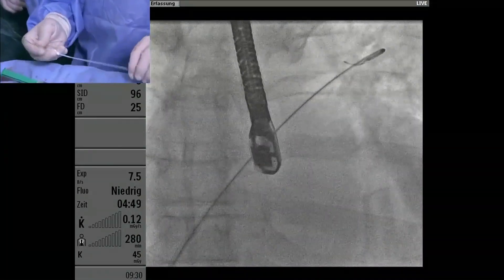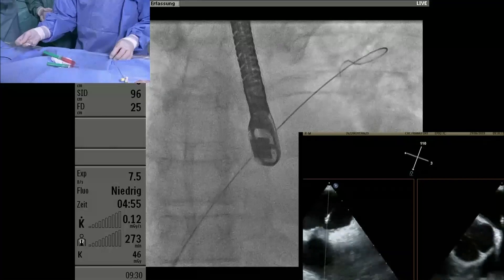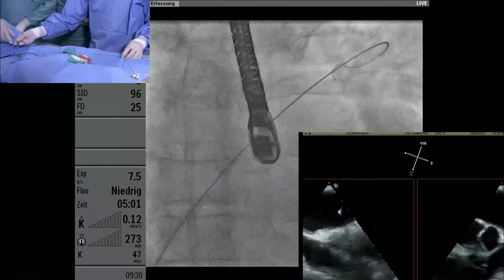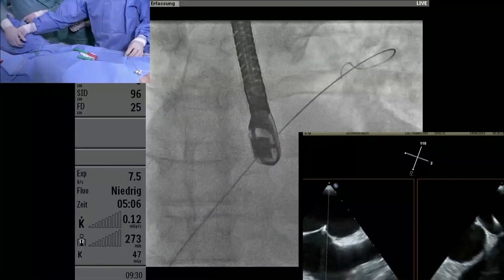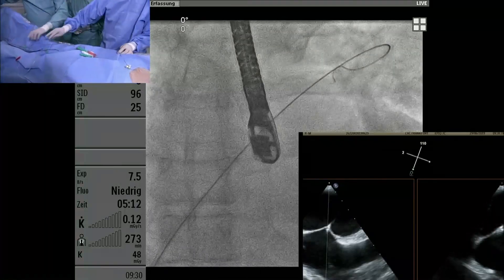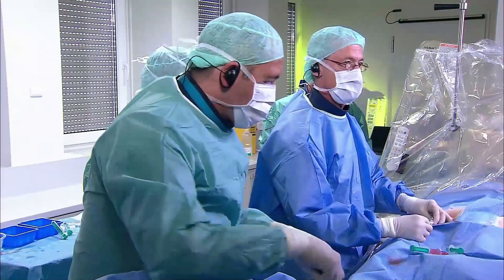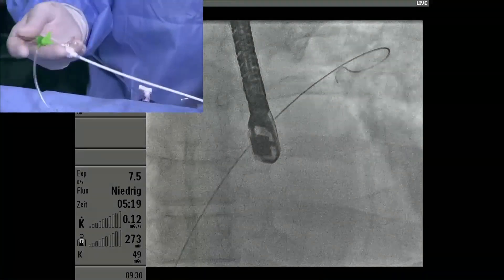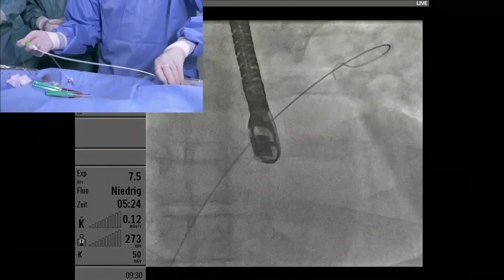I have with me Pratak Matic, Martin Swans as I mentioned, and Boaz from Vectorius - he's on my side here to make sure I do not mess it up. We also have Deddy in the room; he is also from Vectorius and can answer any questions. While working with the Vectorius device, one of the questions that Kolya had was about durability. Kolya, do you want to talk about your question for Vectorius?